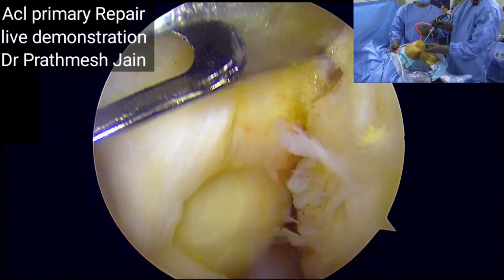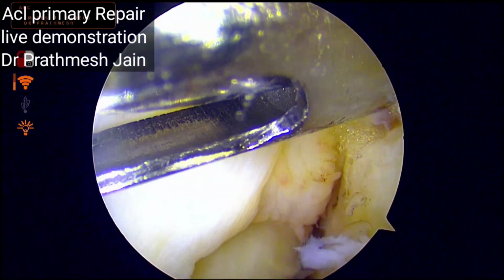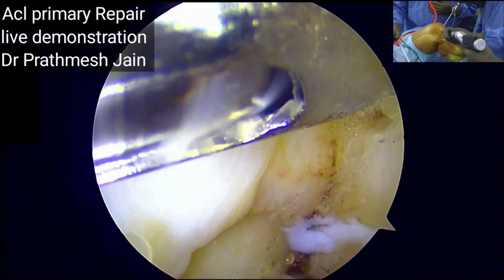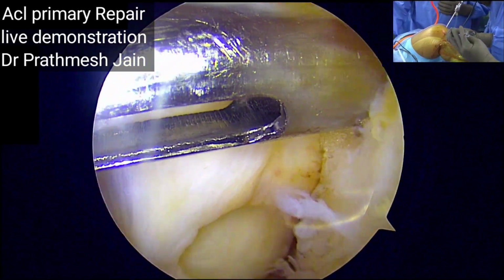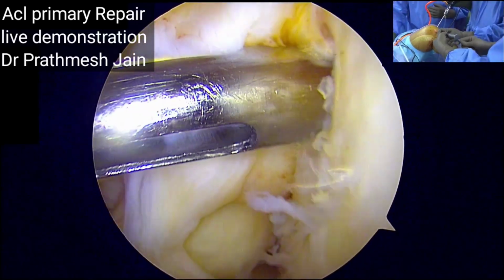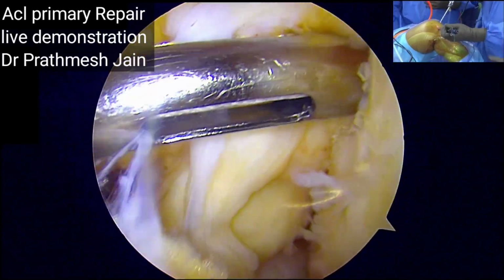Go ahead. So I would usually recommend doing a double row kind of repair, because I would like to do a bundle specific kind of repair. So we all know that the ACL has two bundles, the anteromedial bundle and the posterolateral bundle, and I would try to reinforce both of them by use of two all suture anchors.